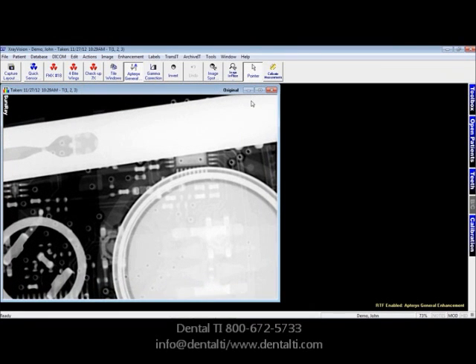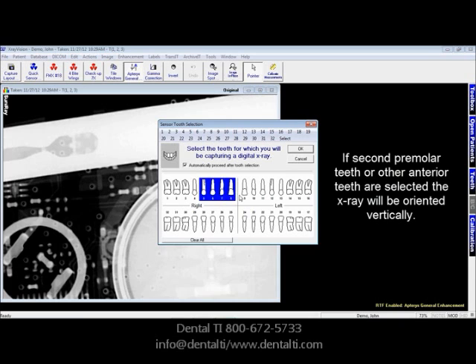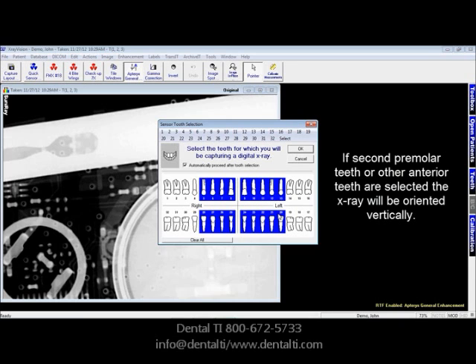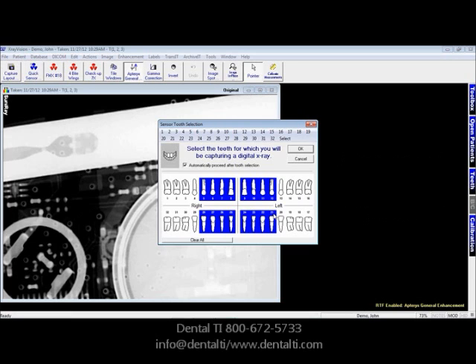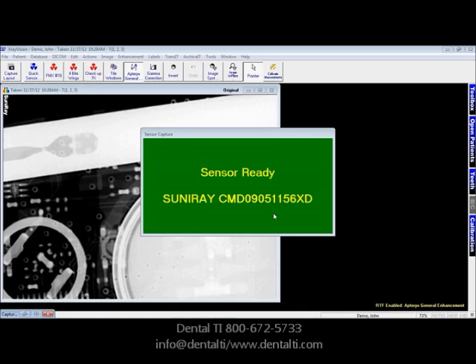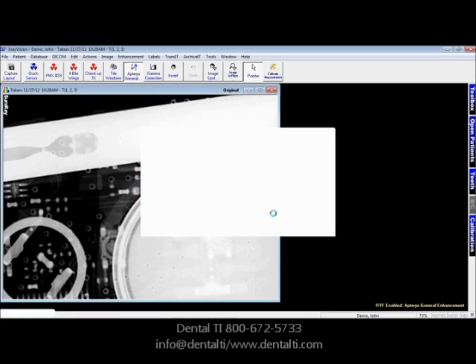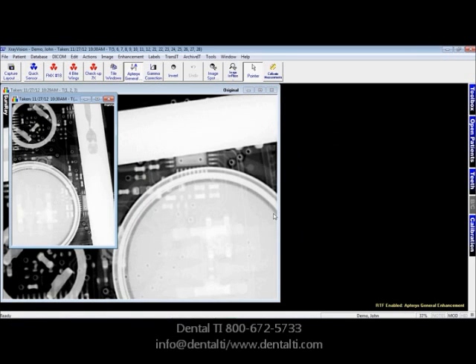If you're taking an image of an upper PA, you would select Quick Sensor. Anything from 5 on in will orient the image vertically. You'll notice the first four teeth — if they're selected on the anteriors, upper or lower — the X-ray is going to be vertically oriented. Here the image is vertically oriented.